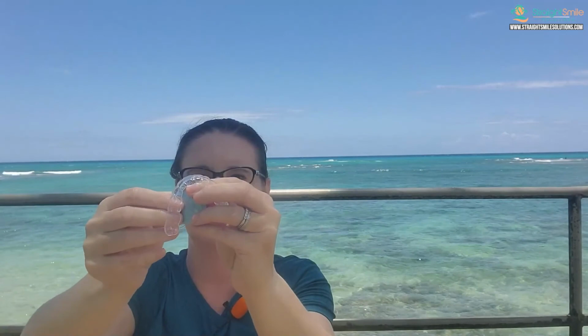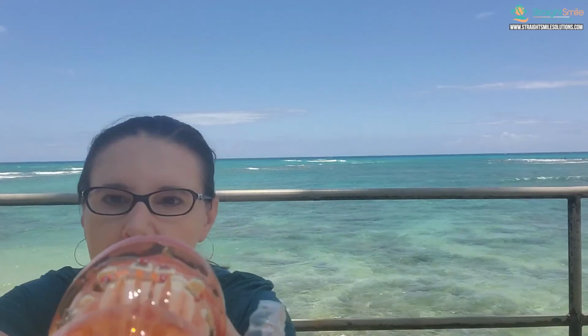Hang on. So you can see here, there's a model here. I'm going to show you how to put it on. So it's going to be in this individual package. You're just going to open it up. And these are completely sterile, which is great. I mean, the patient's going to be doing this at home. You're going to grab it. You're going to go ahead and press it on the bracket.